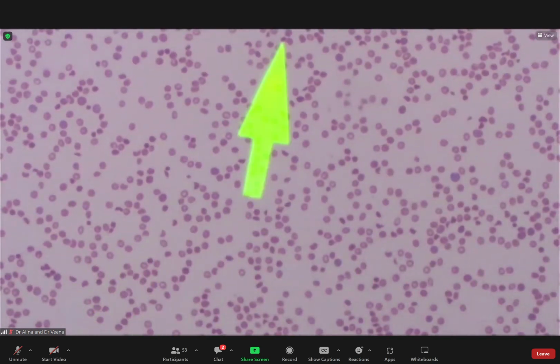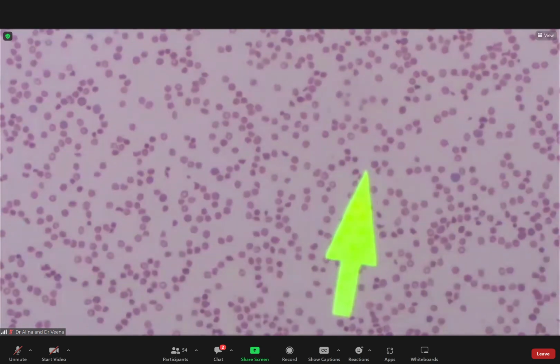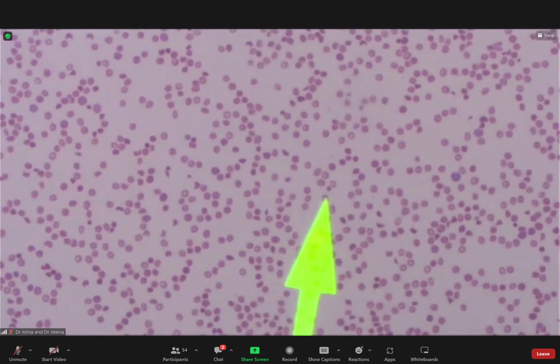So this is very typically MAHA. Schistocytes. Anyone got it wrong? Microspherocytes. Anyone got the diagnosis wrong? Anyone? Are you MOs or hematopaths? Forensic pathologist. Okay. Part 1. What about you? Pediatrician. Sorry, he didn't hear.